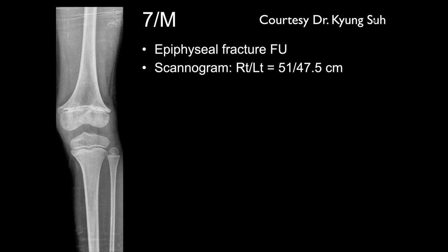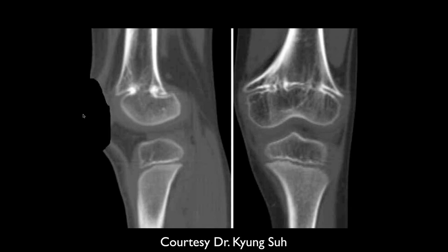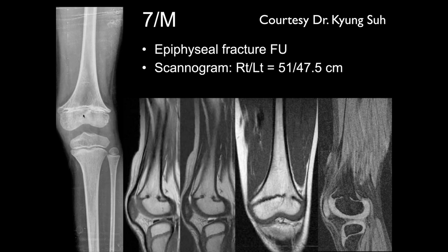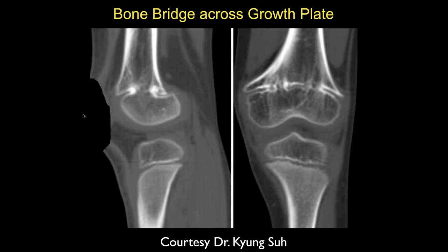This patient is a seven-year-old male with epiphyseal fracture follow-up. Looking here, we can see osseous bridging of the epiphysis of the distal femur — a bony bridge — and you'll probably get asymmetric growth on that side. What you do is go in, open up, take out the bridge, put in fat from the buttocks, and it'll stay open. You may get overgrowth. These don't work 100%, but if they don't work early, after surgery you repeat it. Usually these turn out pretty well.